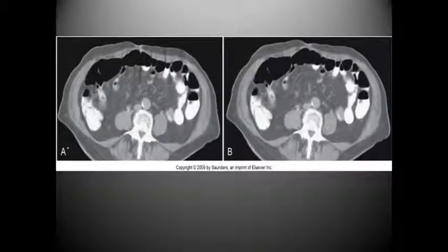Additionally, you may have this image. This is what it looks like when a patient is breathing. In image A, as you can see, the abdomen where the patient is breathing has streaks throughout it. This would be a streak artifact, but also it would be a breathing or patient motion artifact. Notice when the patient actually holds their inspiration, we don't get any of this.